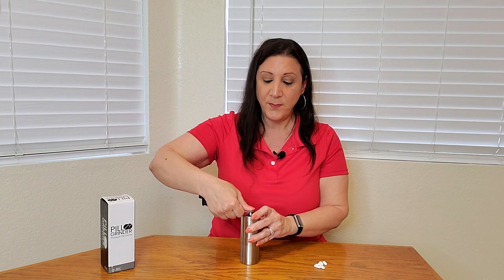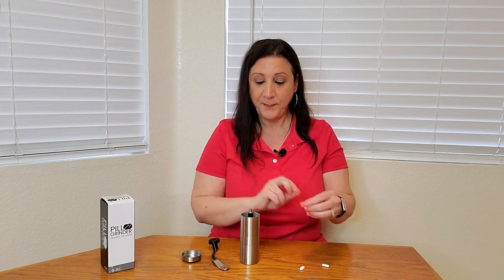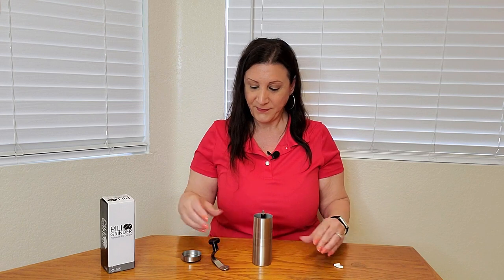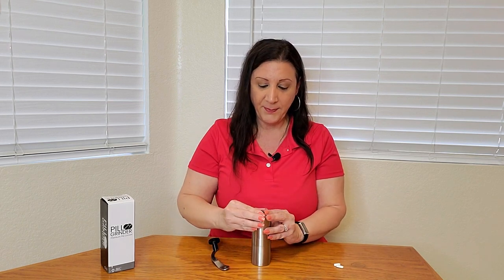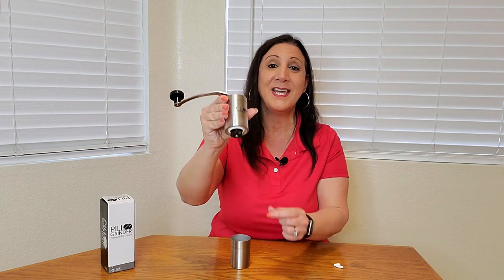Now let me show you how easy it is to work. You're going to remove the handle and take off the top, and then put the desired pills inside. It's so large you can put several pills inside it as well. Then put the top back on and the handle back on as well. The bottom also has an adjustment where you can make the coarseness of the pills either finer or coarser — if it's too hard you can just adjust it to your liking.